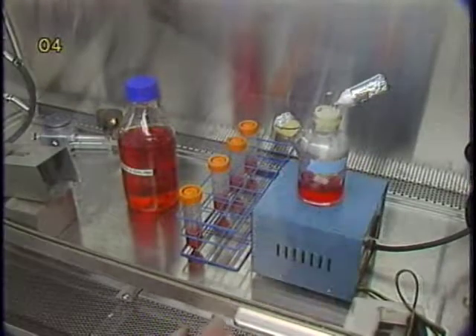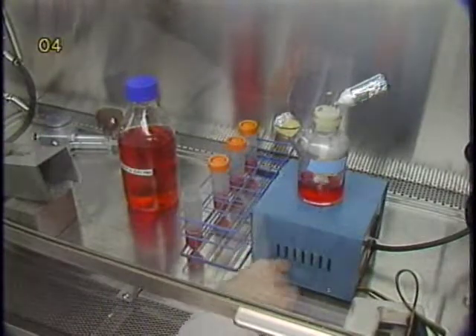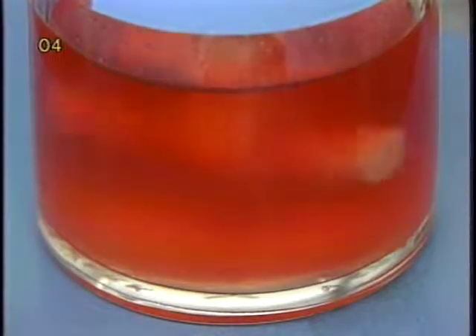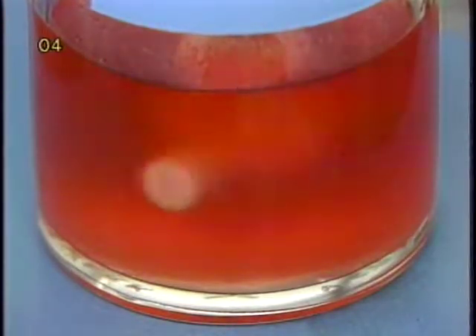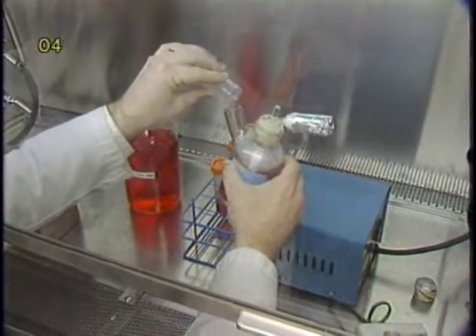Before inoculation, the microcarrier spinner flask is removed from the incubator and placed on a magnetic stirrer in the laminar flow hood. A slow agitation is used to ensure that all the microcarriers are kept in suspension. The balance amount of the medium is added to the flask.